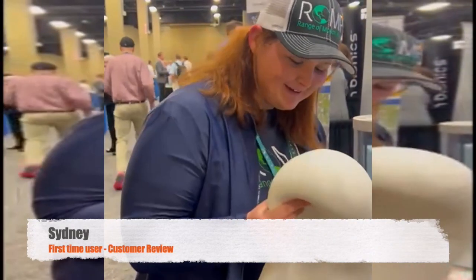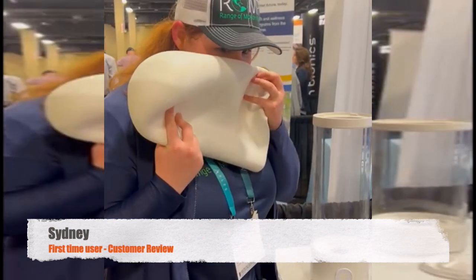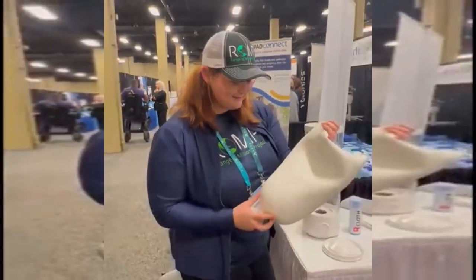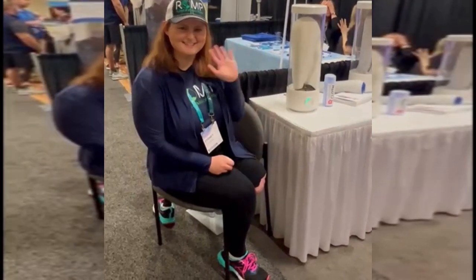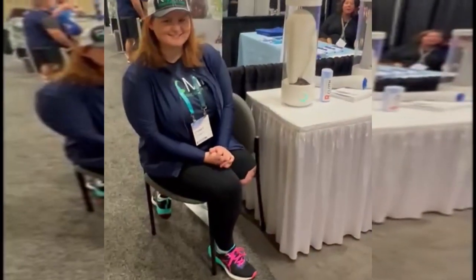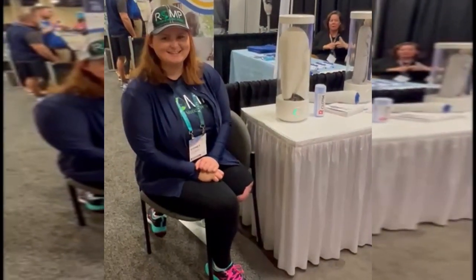Wow! Oh my gosh, this is awesome! I love this! This is the coolest thing! We're here at Academy today in Nashville, Tennessee with Sydney. Sydney just tried the Ross Automatic Liner Sanitizer for the first time.